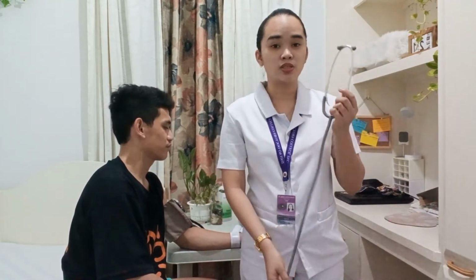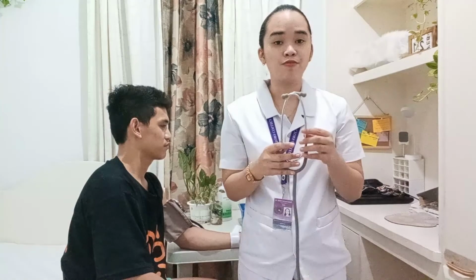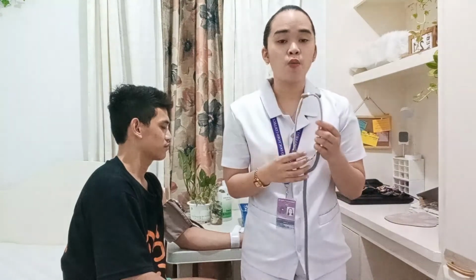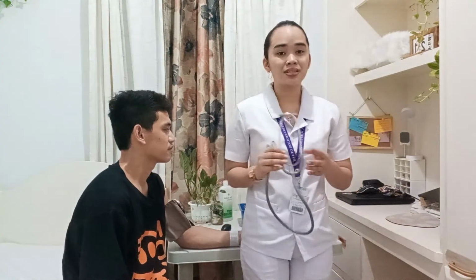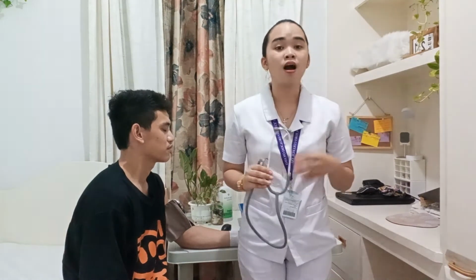Now, I'm going to insert the ear attachment so that it would be tilted slightly forward. It is important because sounds can be clearly heard when the ear attachment follows the direction of the ear canals. Also, ensure that the stethoscope hangs freely from the ear to the diaphragm, because if the stethoscope rubs towards an object, the noise can block the sound of our blood pressure in our arteries.